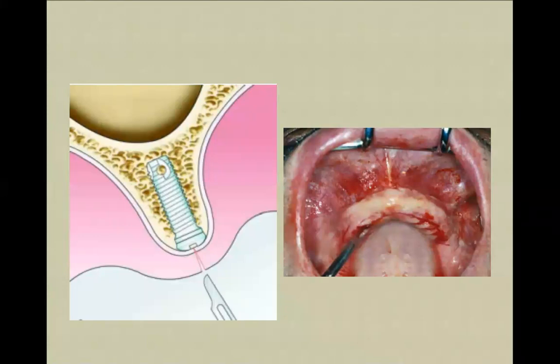And you have to do a postoperative OPG, at least a postoperative OPG, to be sure that half of the length of the implant is not inside the sinus. Otherwise, you have to take it out. Yeah. If there's only one thread, okay. Sometimes it's just a reaction of the mucosa of the maxillary sinus.